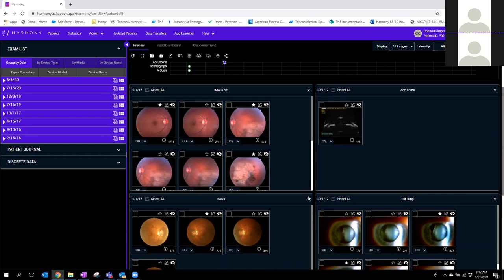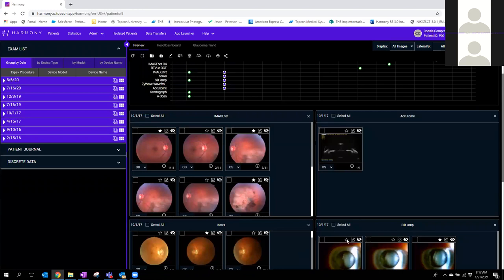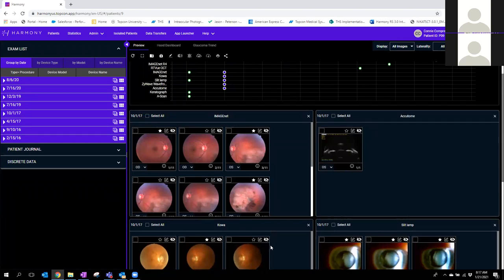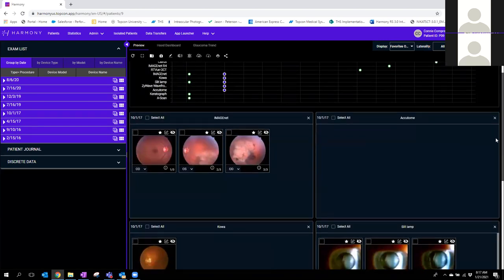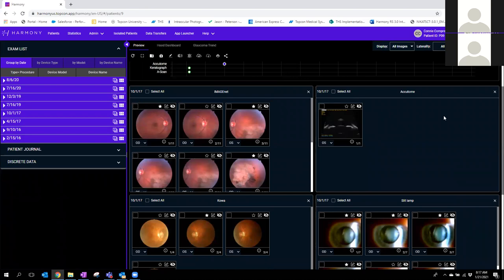In the default all-images view, direct your attention to the second toolbar. These drop-down menus are for sorting — right now it's displaying all images. If there are images you want to single out of interest, you can click the star icon to mark favorites, similar to favoriting photos on your smartphone. You can click on these star icons as a favorites marker, then come here and select 'favorites only' to narrow things down. If you ever see a modality box that's blank, it's probably some sort of filter applied up here — go back to 'all images' to see everything.